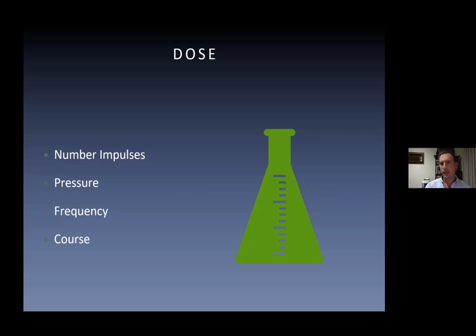The frequency is going to affect a few things. Generally, lower frequency will give you better penetration. So if you're treating something deeper, use a lower frequency. And this is the number of hertz. So for example, when I'm treating most tendinopathies, I'm at around 8 to 12. If I'm treating the insertion of Achilles, I'm treating more at 12. Something that's a bit deeper, like the greater trochanter, I might treat at a lower frequency, more around 8 hertz.